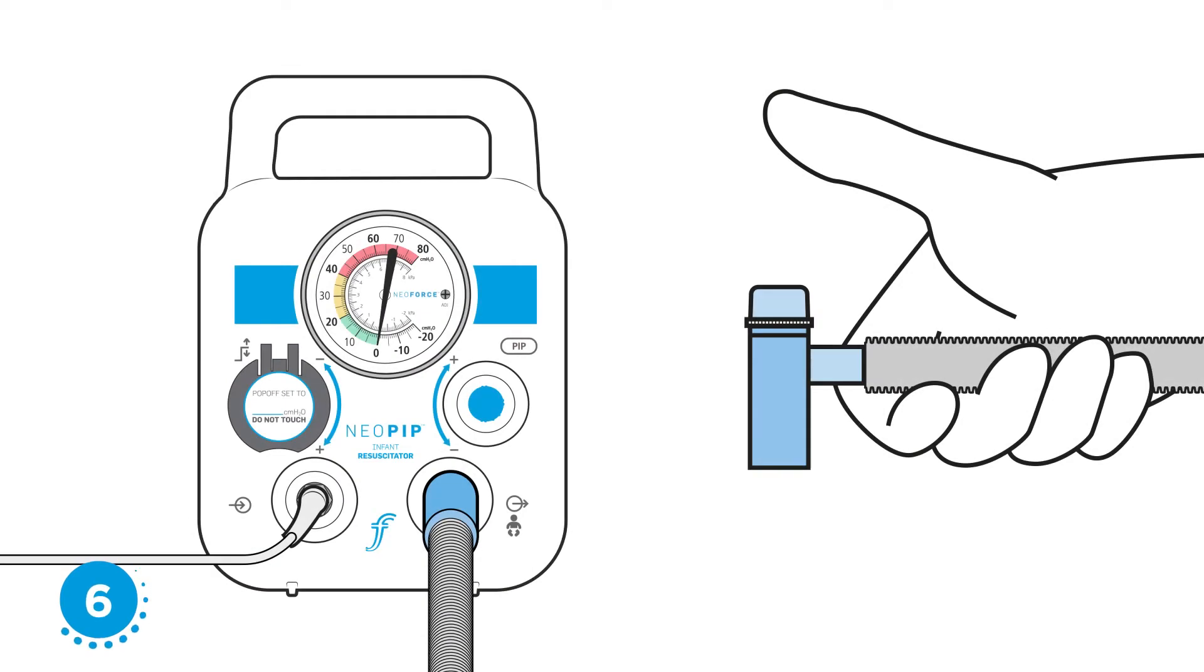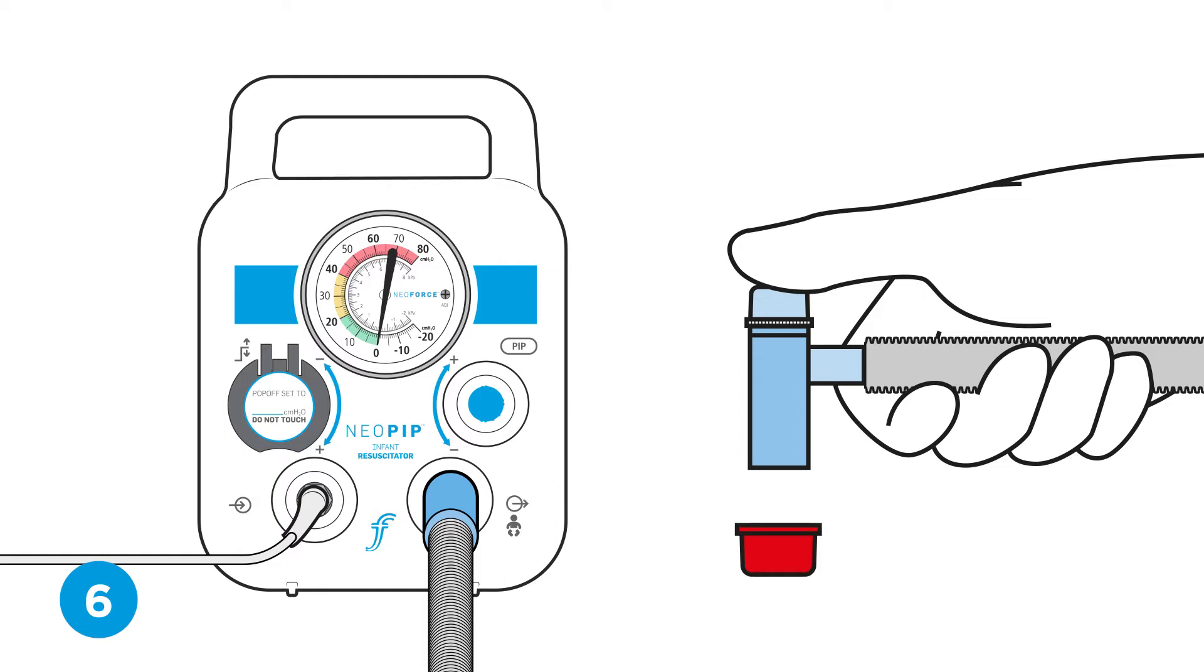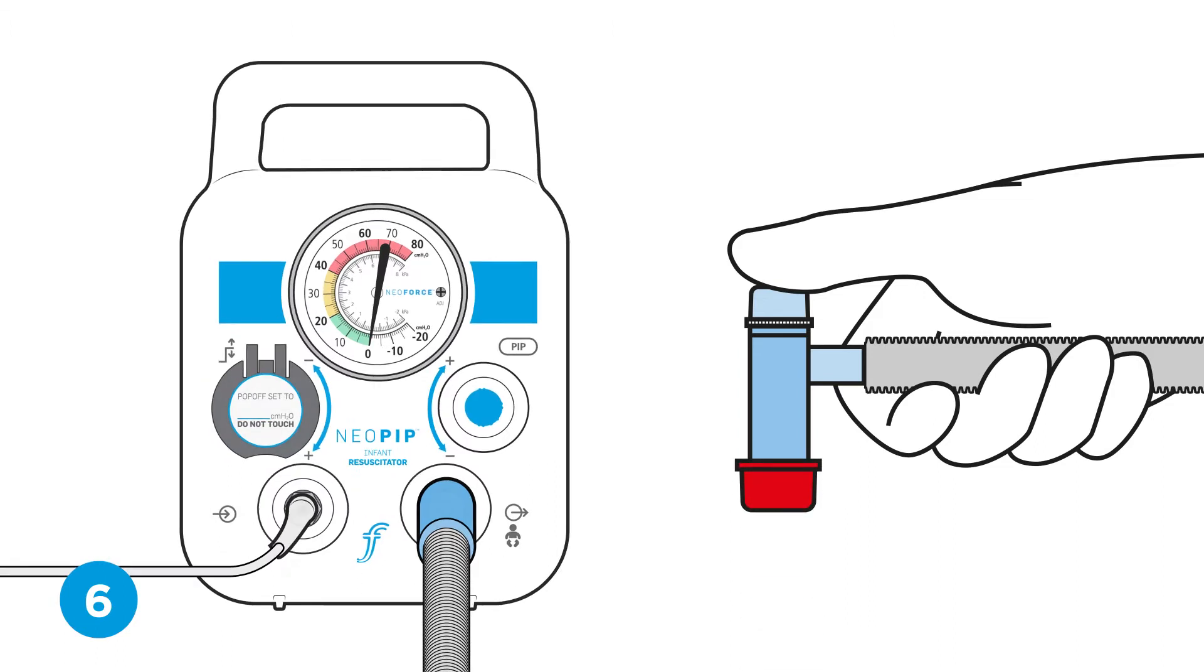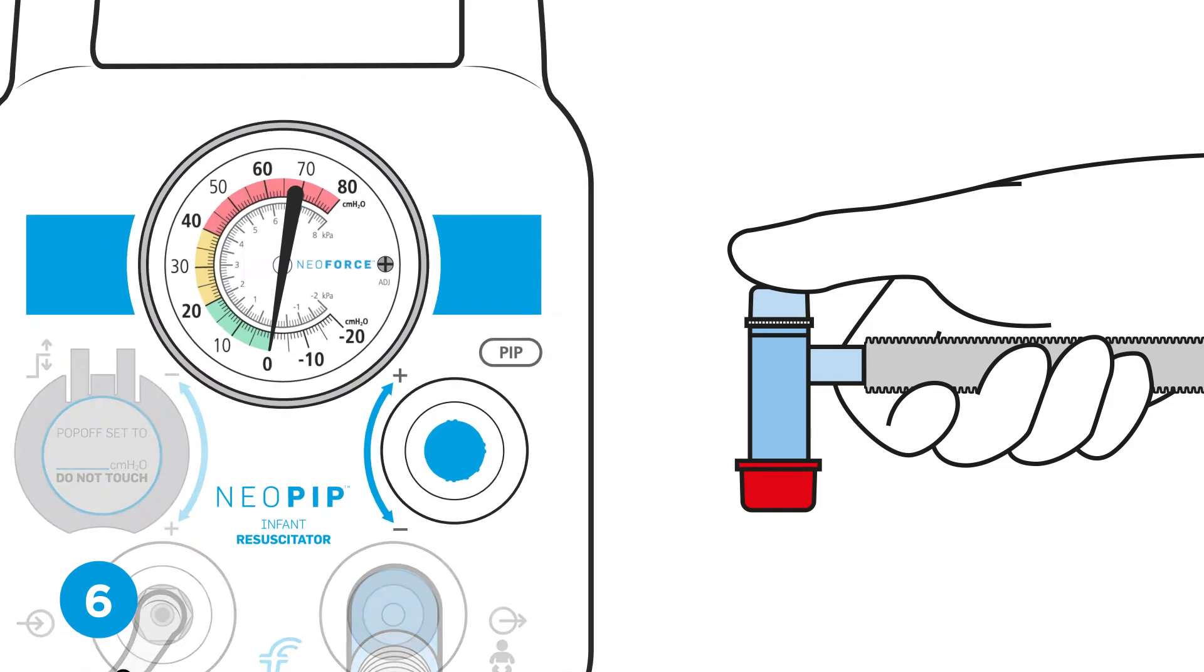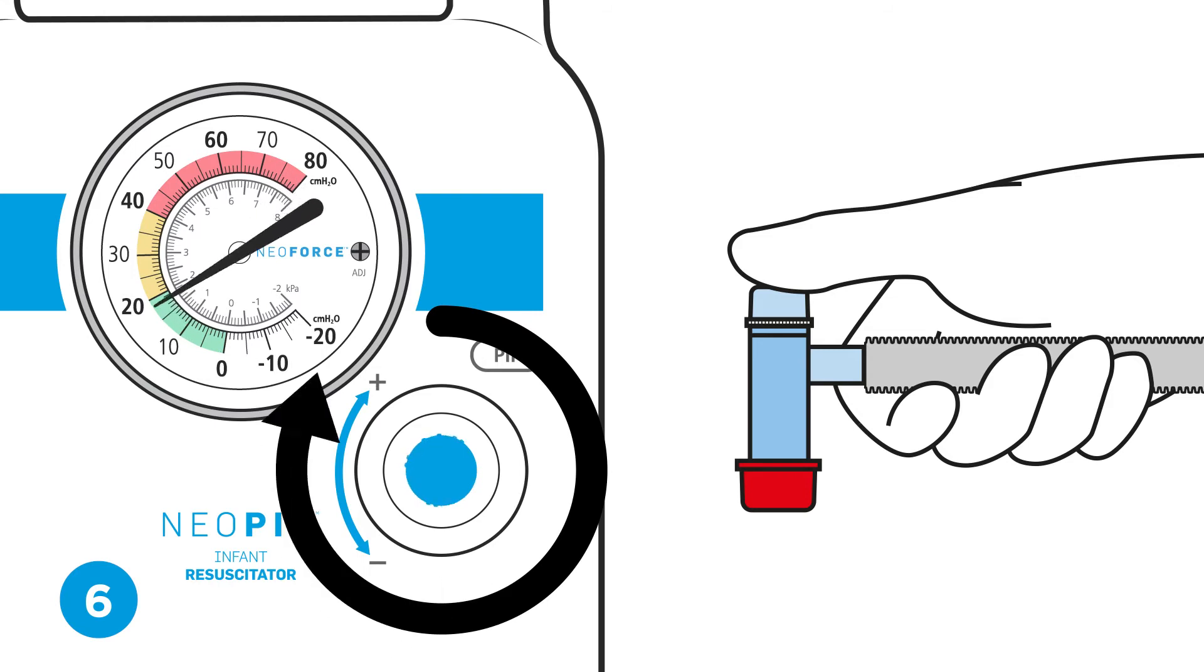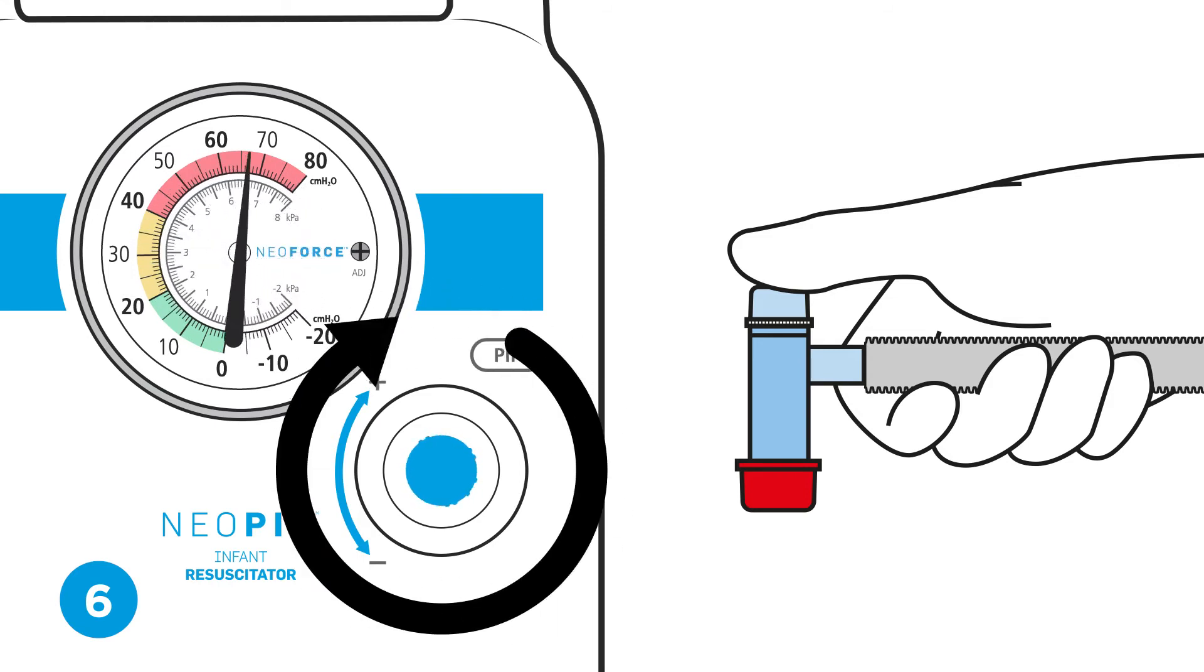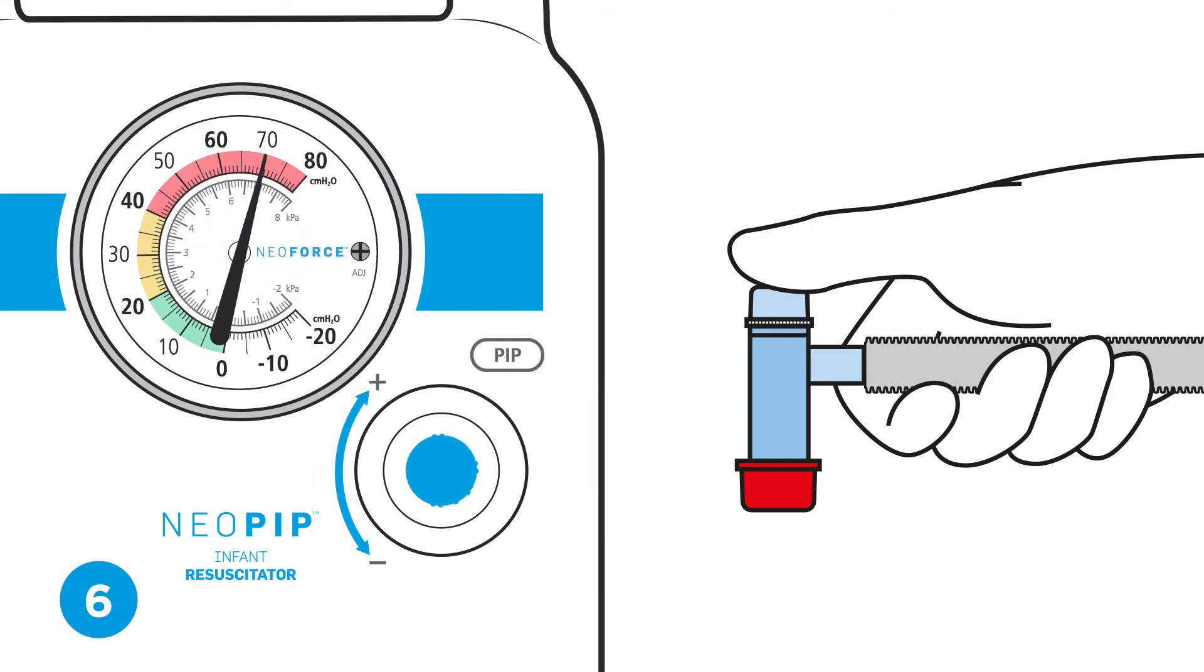Step six, check PIP setting. Occlude both the PEEP valve using a thumb or finger and the TP circuit outlet using the red cap. With the TP circuit occluded, turn the PIP control several turns clockwise to increase the PIP level.